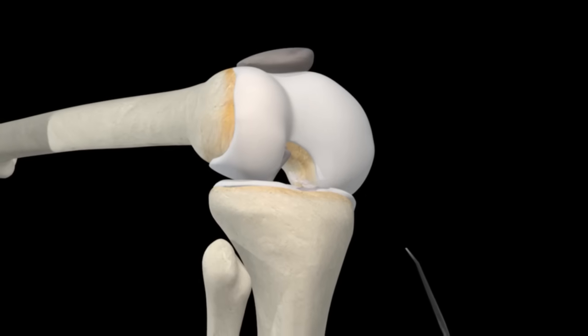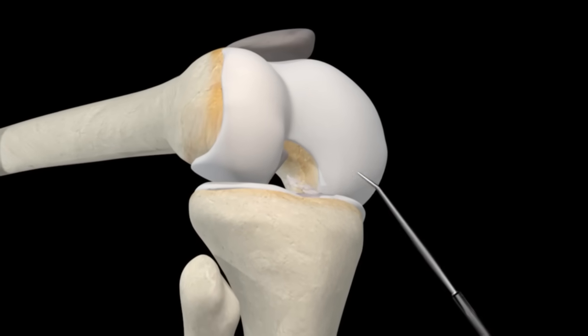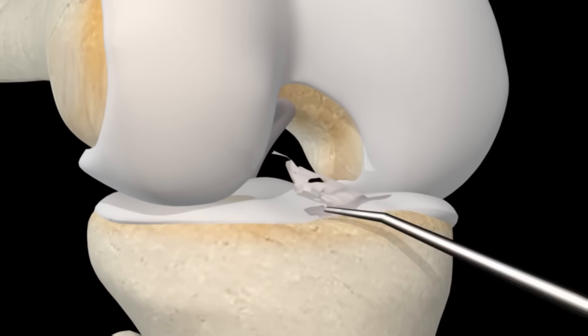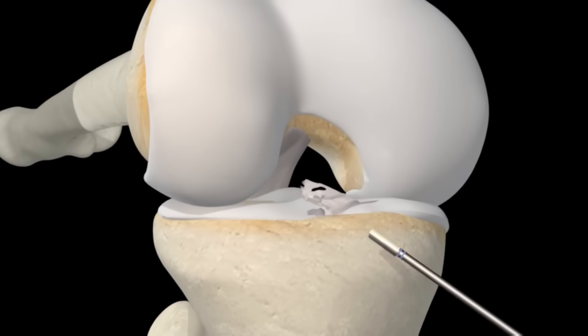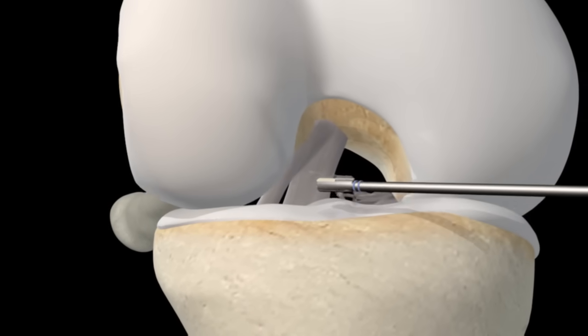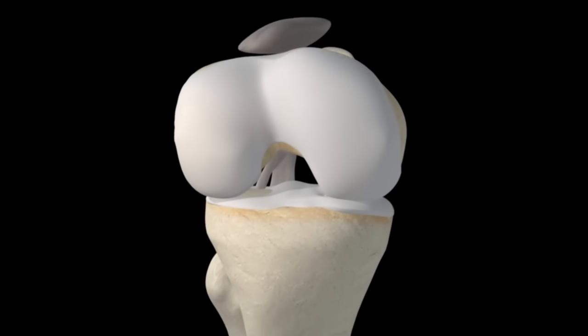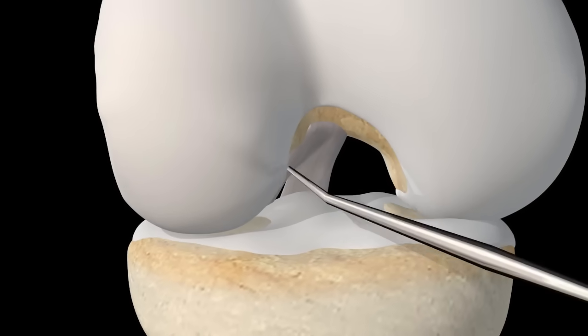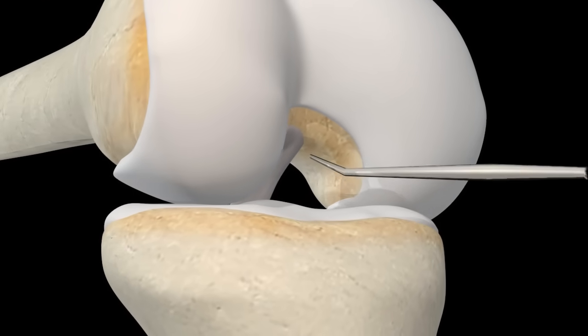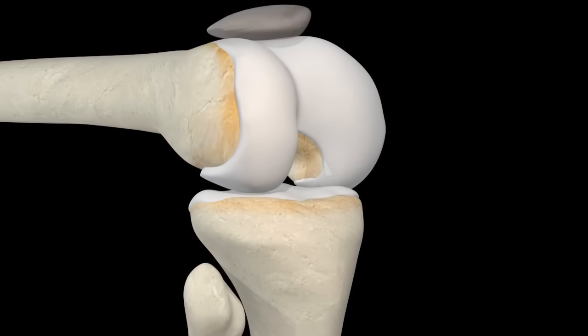To start the procedure, the surgeon will insert a probe to inspect the damaged joint. A small motorized shaver will then be used to remove the damaged ACL and prepare the area for the new one. In every case, a surgeon will also inspect the entire joint to determine whether there is additional damage warranting other repairs.